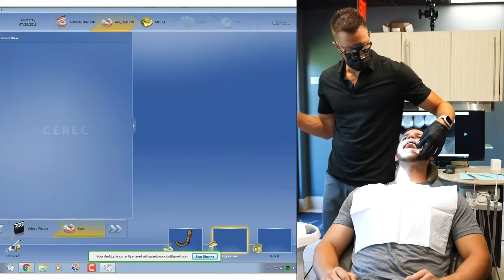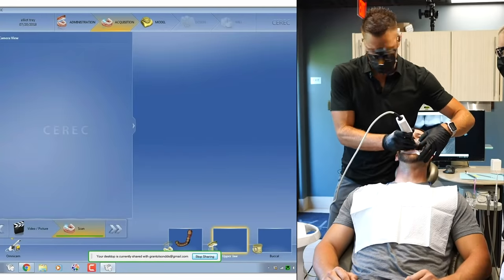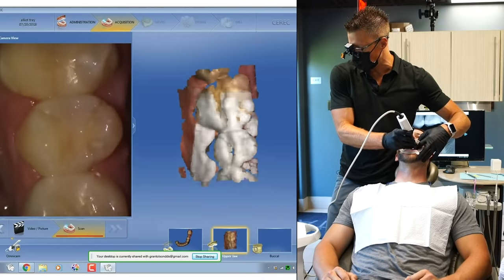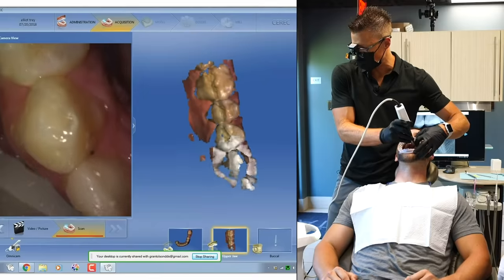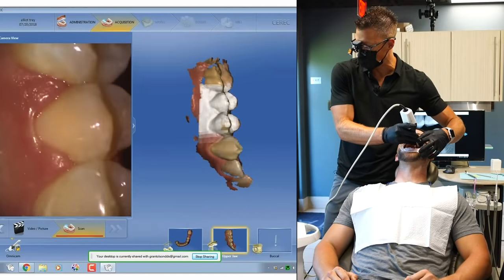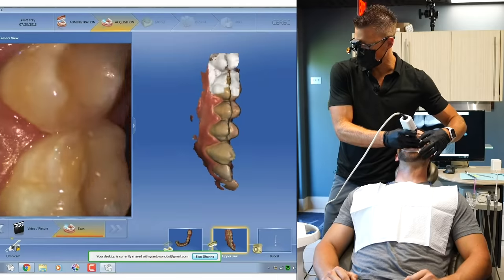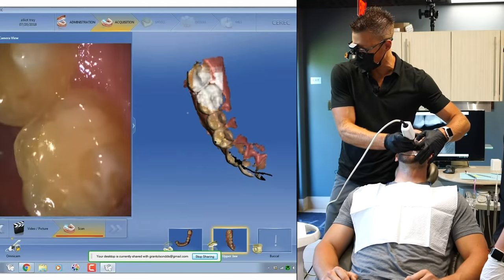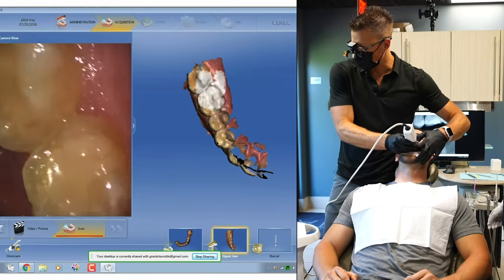I knew you were in cross bite. I didn't know it was that large, but hey, we'll work with that. So what's kind of cool about this is he's got a bite that normally, if I were to just plan that crown and place that implant right over the ridge without any idea of where that future crown would be, there's a good chance I'd be off and not place that implant at the proper angle. And so we create some problems when we do that.